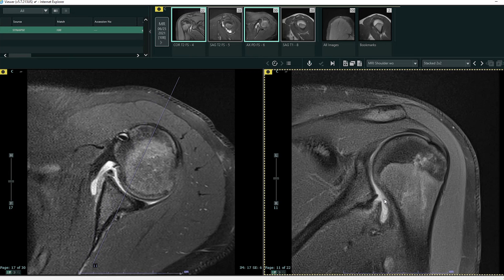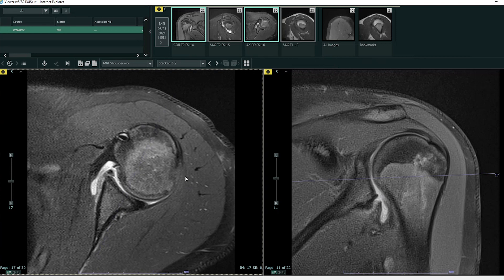What happens with these patients is, especially when they're younger, they're very prone to dislocate again if this is not surgically repaired. This patient will have to have their capsule repaired and will need surgery, unfortunately. This is the time of year where we see a lot of these injuries, and it's something we're very comfortable diagnosing. Hopefully you get an appreciation for what we're looking for and just how well we can see this type of injury.